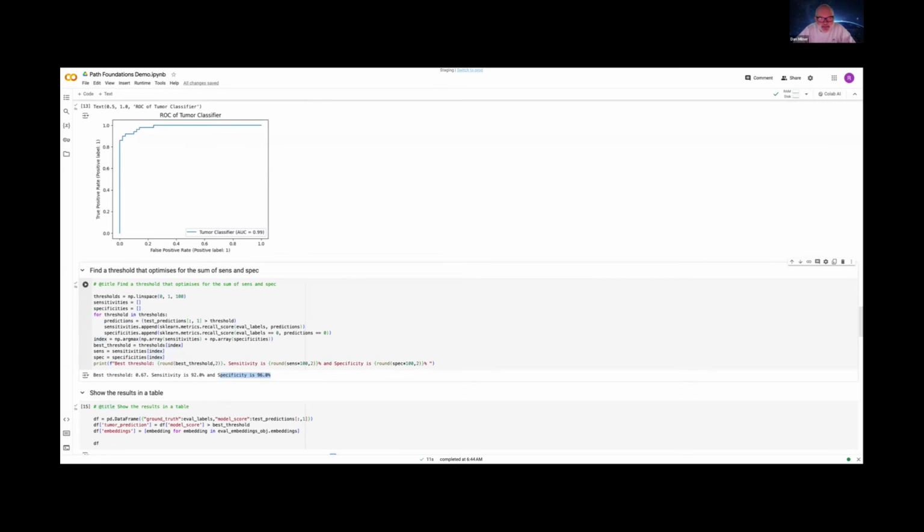And then I have a little bit more of a philosophical question, I guess it's more of a mathematics question. The question is, you are feeding this patches of positive for tumor, negative for tumor, false positive for tumor, false negative for tumor, around a specific tumor. So you're feeding it hundreds or thousands of slides of the same kind of tumor from the same tissue and saying, this is normal, this is not normal, this not normal is cancer, this not normal is a false positive, et cetera. And it's a compare contrast kind of algorithm where you're asking it to learn by comparison.